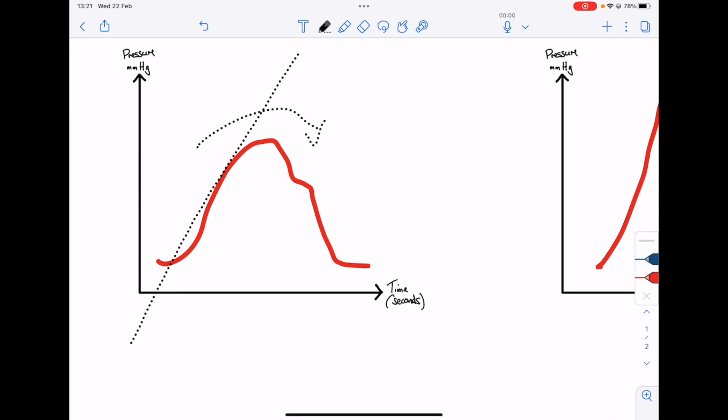So from these you can infer that ejection from the start of systole to the end of systole is taking a longer time, and things that cause that would be aortic stenosis, chiefly.